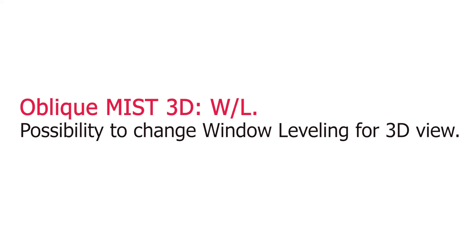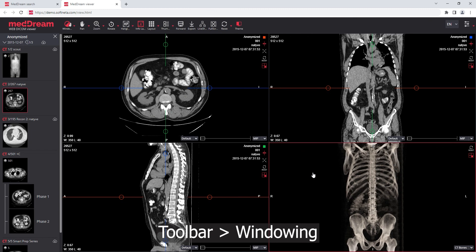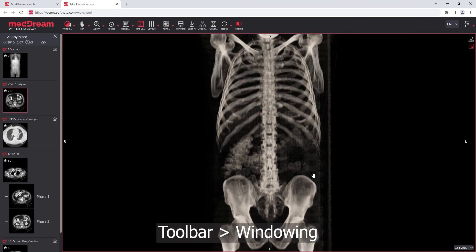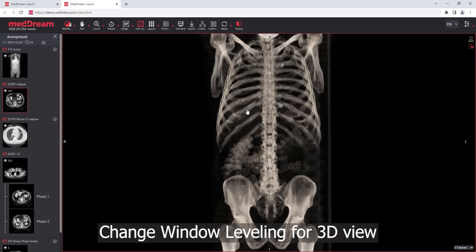Oblique 3D: possibility to change window leveling for the 3D view. Choose windowing in the toolbar and change the window leveling for the 3D view.